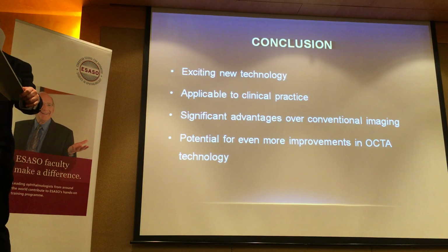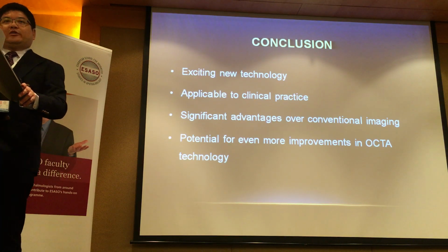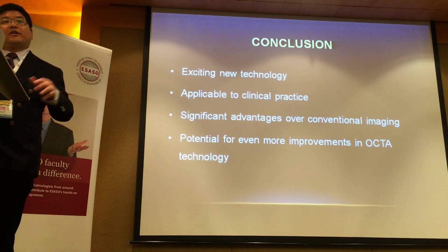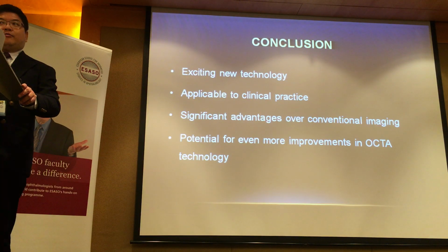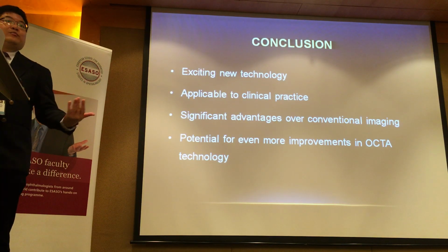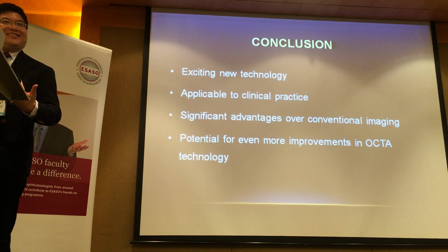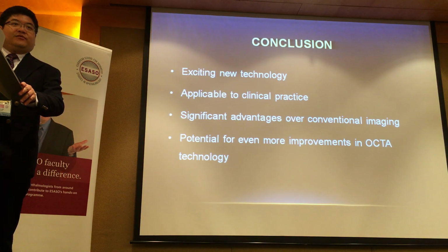So that's a good question. Unfortunately, I don't have any full images here, but perhaps I could just share some of my thoughts on this. There's of course the criteria that Koskas described about the type of lesion, and I think he's shown that in his team's hands they can be quite indicative. I would of course correlate this with other factors, namely the patient's symptoms. Is the patient symptomatic, is the vision dropping? Clinically, do you see anything? And of course, on the cross-sectional OCT, do you see activity?